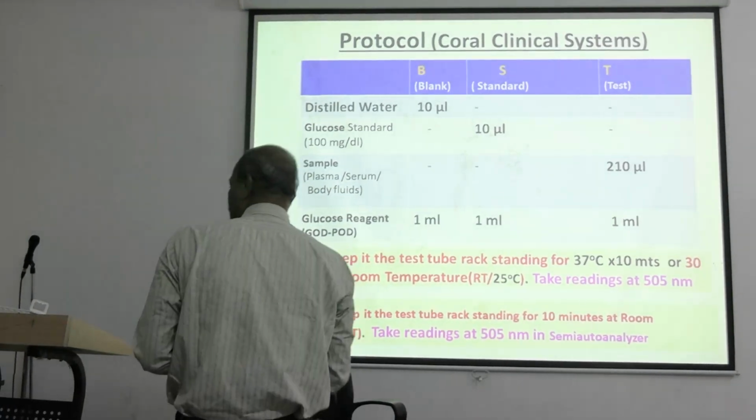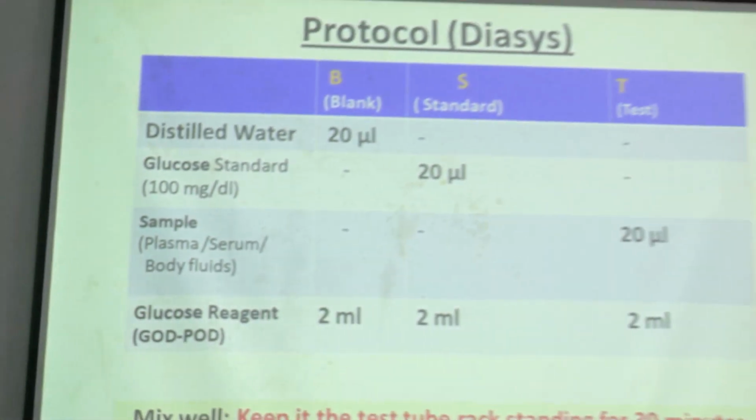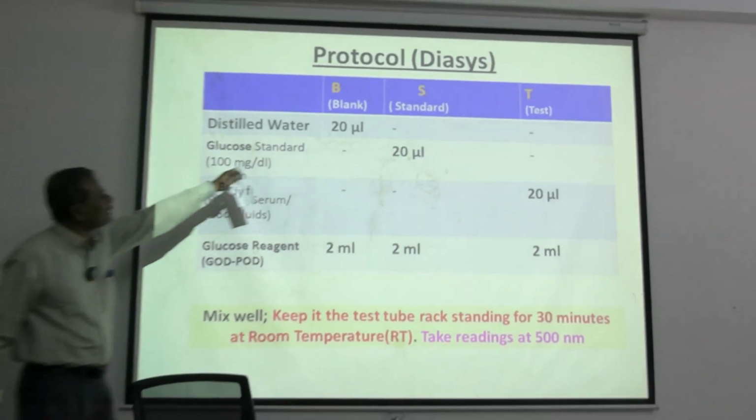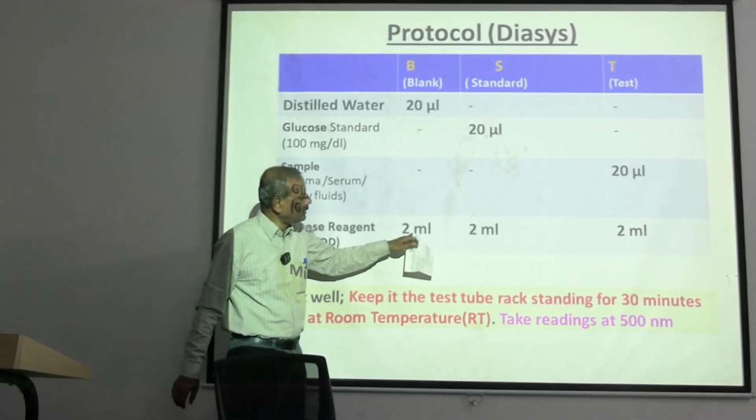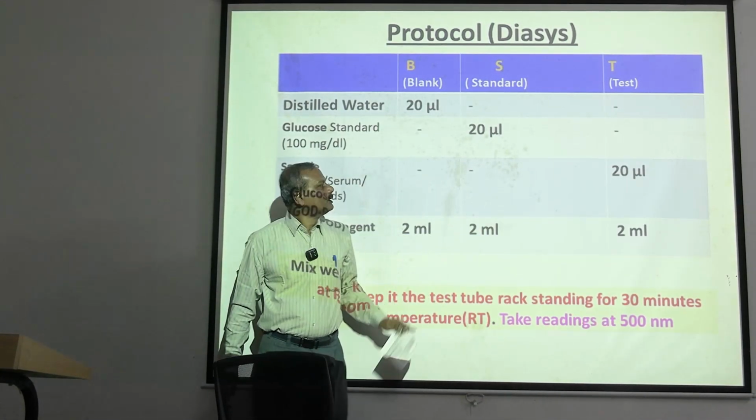I can show it to you. See, there are other companies which are also manufacturing the same thing. So you see the reagent here, volume is, they have taken 20 microliter, 20 microliter, 2 ml, and then reading is taken at 500 nanometer, okay.